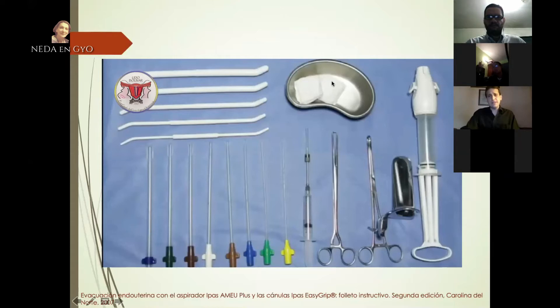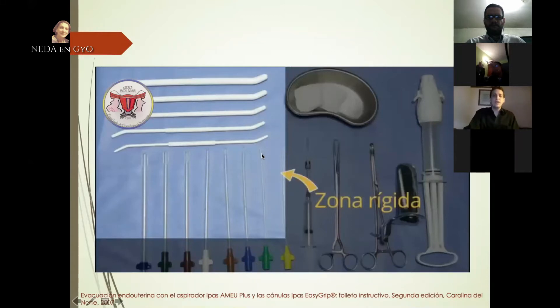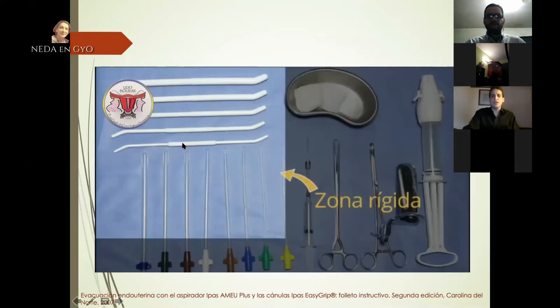También tenemos la riñonera, que es donde vamos a verter los restos obtenidos posterior a la aspiración. Se evidencia un área delimitada denominada zona rígida, que no puede ser manipulada por ningún médico que esté realizando el procedimiento, debido a que estos extremos distales —por ejemplo en las cánulas— van a estar en contacto con la cavidad uterina. Mientras menos manipulación, menos riesgo de infección. Los dilatadores de Hegar pueden tomarse por el extremo medio, ya que este no tiene contacto con la cavidad uterina.